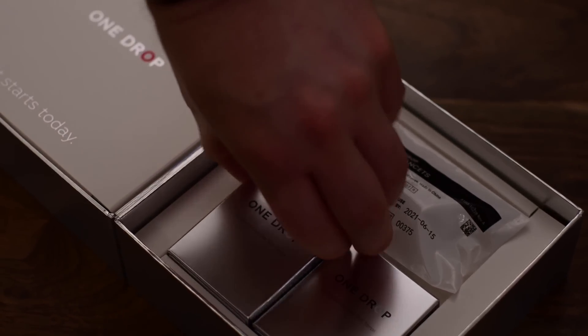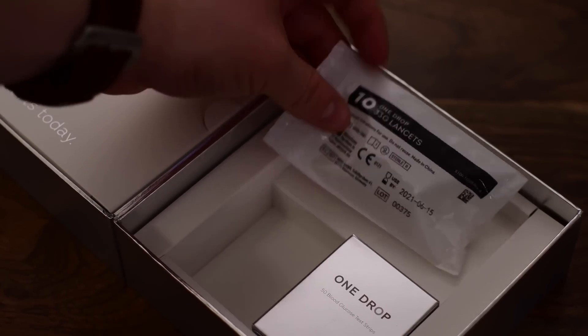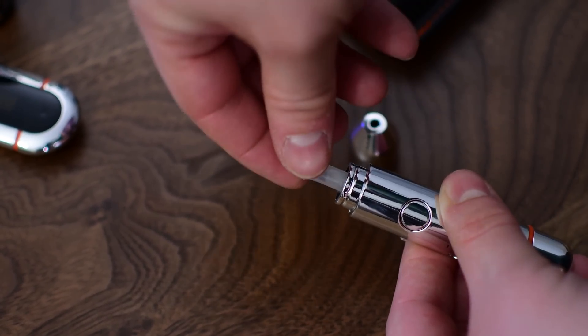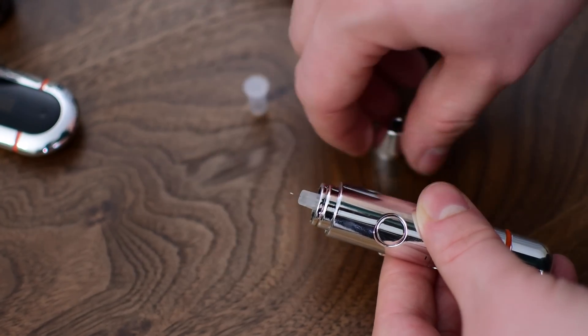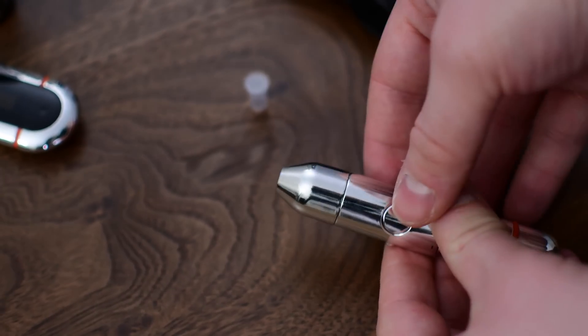There are also two boxes of test strips — each box has one vial, and each vial contains 50, so you have 100 total strips that come with the kit. But if you do sign up for the subscription service, aside from the meter, you will also get unlimited test strips as you use them, and they'll automatically start to send you more. The lancing device is not my absolute favorite one out there, but it definitely gets the job done and works really nicely in this package.